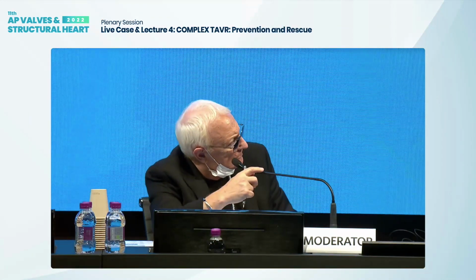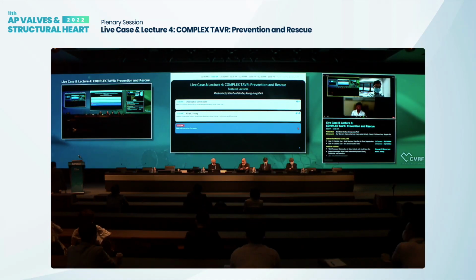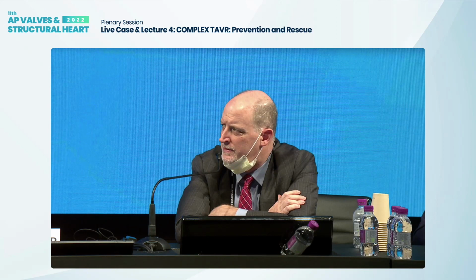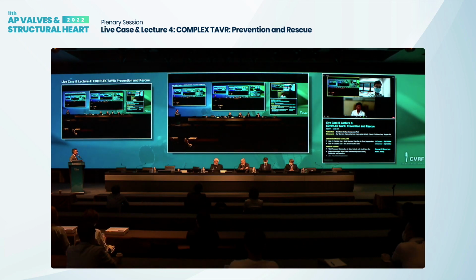Any comments? Yeah, Alan, I had a question for you. That was terrific. Calcium seems to be the enemy still of TAVR, and I think Eberhard touched on this yesterday. What's the role in the future of calcium modification to help settle some of these risks? Calcium modification in terms of removing the calcium from the pre-procedural. There's been lithotripsy, internal, external, for instance.